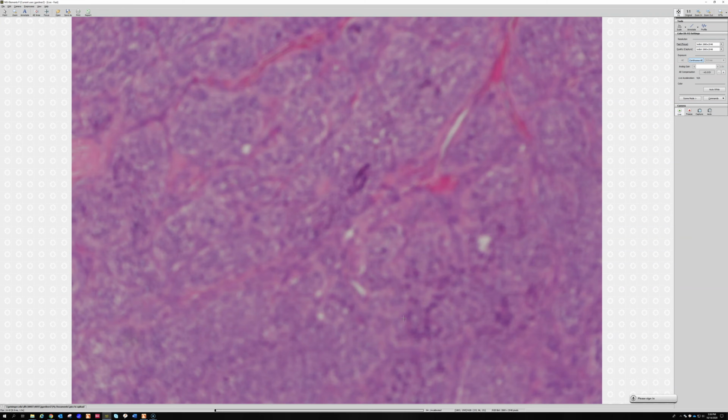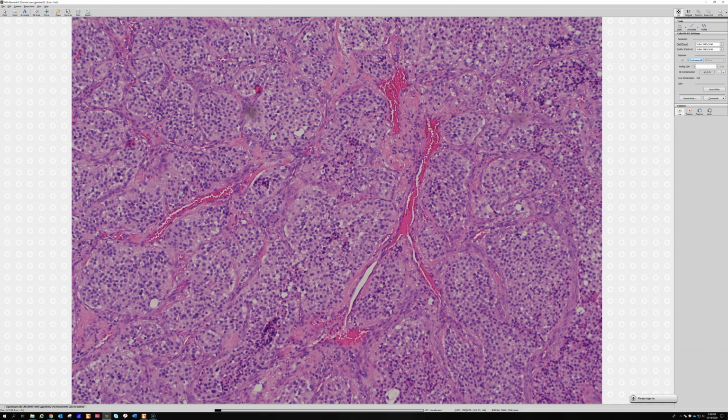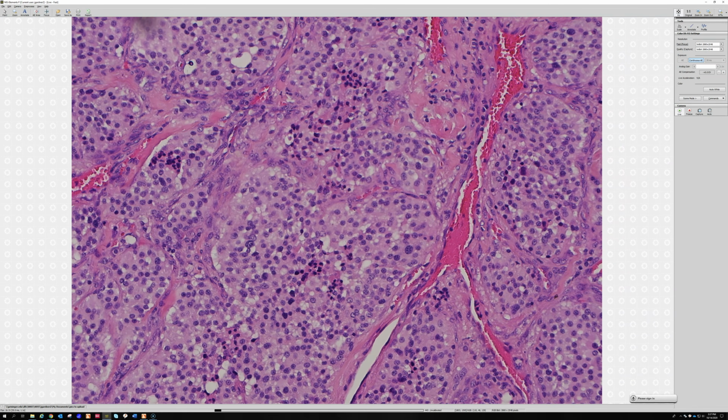Now, obviously, depending on where you're located in the body, a lot of other things can be round epithelioid cells arranged in nests, right? Epithelial tumors of various sorts. There's a lot of other things you could think of. Neuroendocrine carcinomas, like carcinoid tumors and stuff like that. So that can be a real problematic situation in some cases. Obviously, when you're in a classic site like right there in the carotid body, this is the most likely thing.